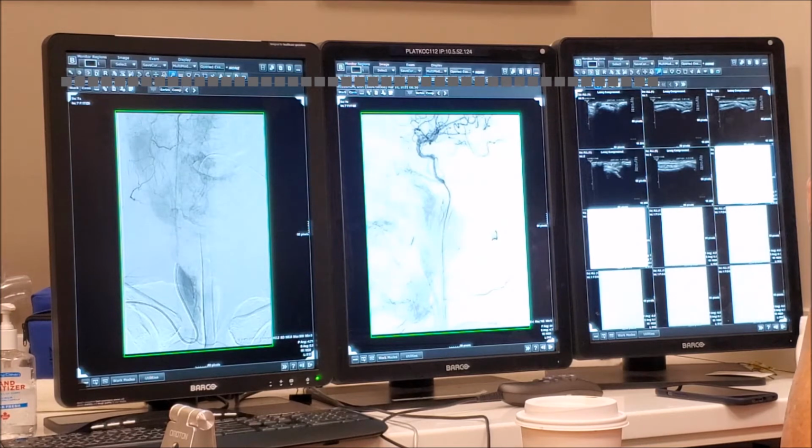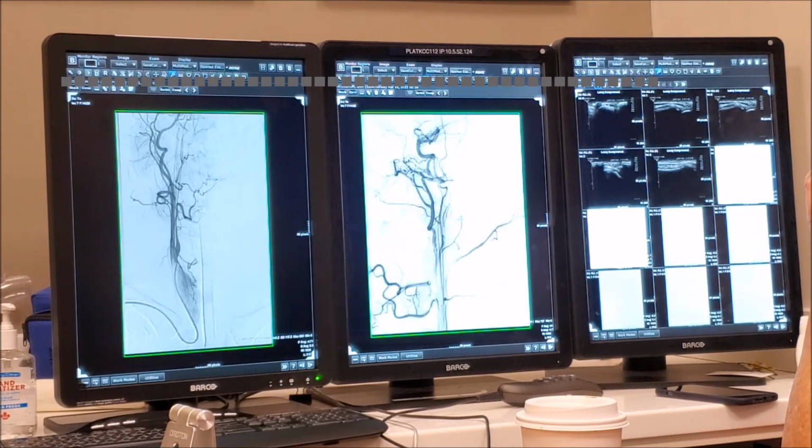Gee, I've never seen a case like this. It's fantastic. So the eye is being exclusively supplied by, well, we have to find the ophthalmic. One second, this is a little more. I'm looking for the ophthalmic now because it's going to be coming out of this one. I have no ophthalmic here, right? There's no ophthalmic.